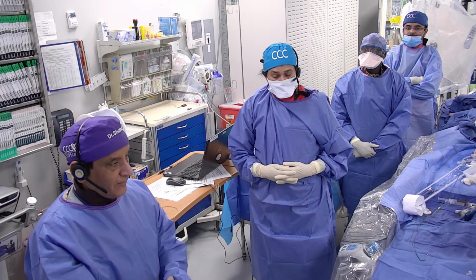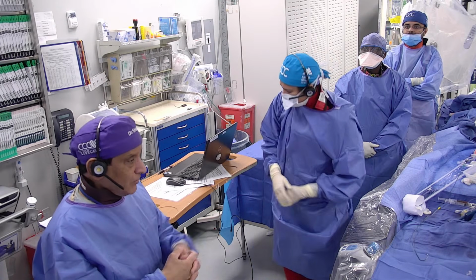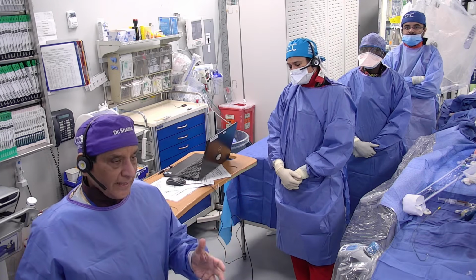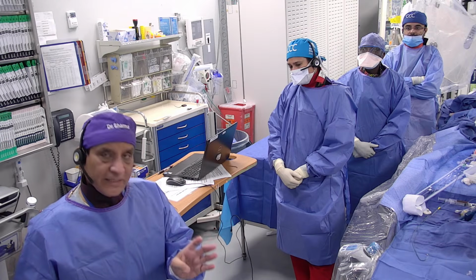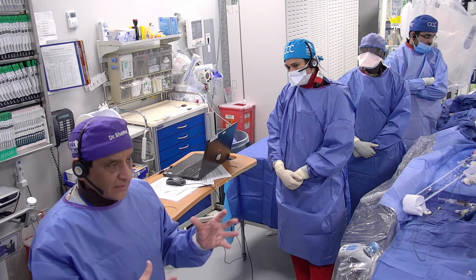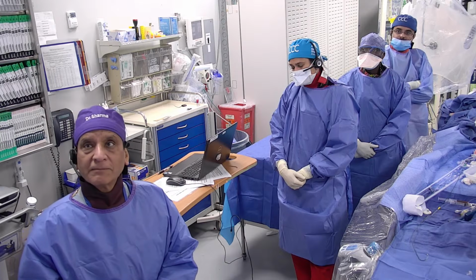I keep that separate. But one of the decisions with the self-expanding valve, although now we have a good competitor where you can have good engagement, is the Navitor. About 10% of our valves at Mount Sinai, we do about 45, 48 TAVR valves per month, are Navitor, for the same reason: the valve struts are open, wider, and there is no issue in terms of coronary engagement.